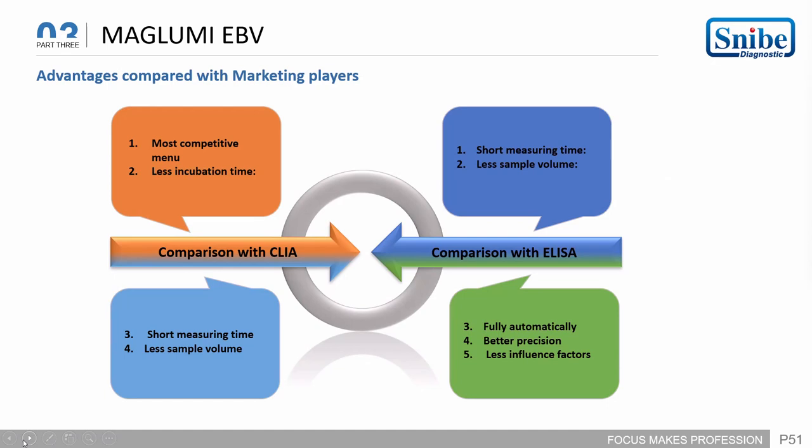Majority competitors like Abbott, Siemens, and Vitros use the chemiluminescence technique rather than electrochemiluminescence. The biggest drawback of electrochemiluminescence with Roche is that all the mixture goes to the measuring cells, and the cleaning of unwanted materials occurs at the measuring cells with the ProCell material, which is called tripropylamine. This tripropylamine has two activities.